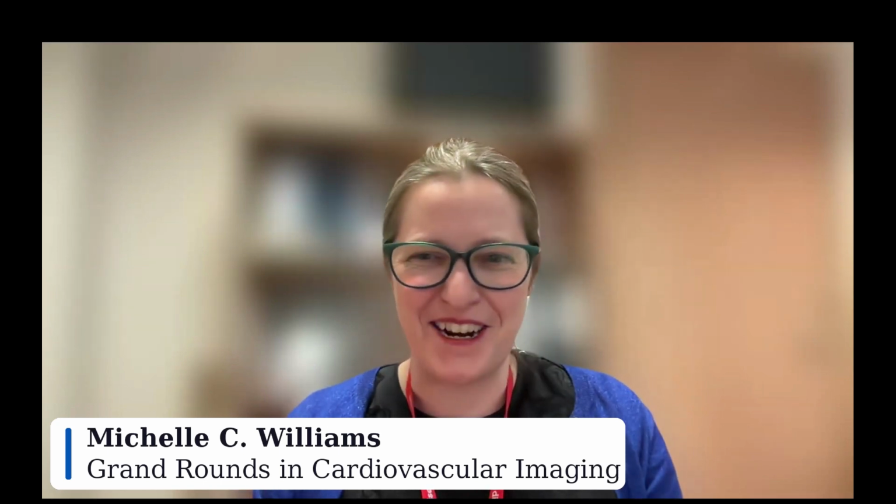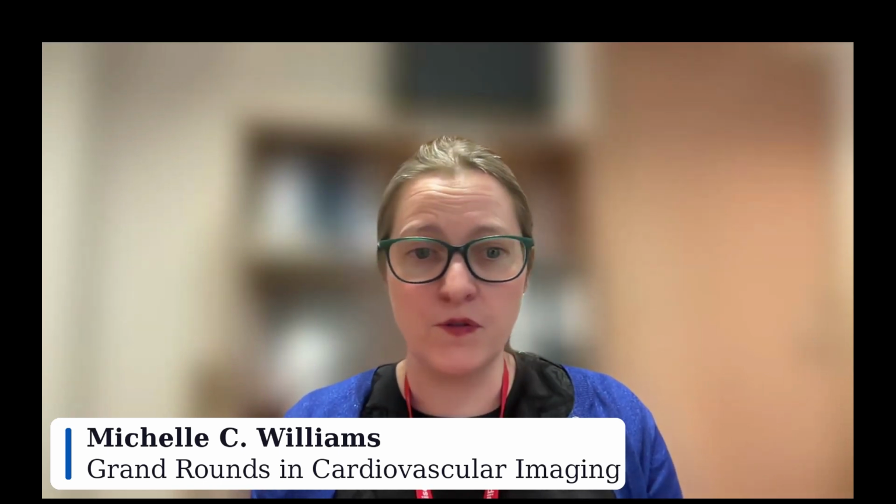And yes, at every different energy, the numbers are different. And that's the same for your attenuation and also your radiomic characteristics. So there's a lot of work that needs done here to work out, well, do we just need different cutoffs? Or can we use this to help us more? Which is going to be the focus of many future projects I'm working on. How soon? It's going to take a while. There's a lot of work to do here.